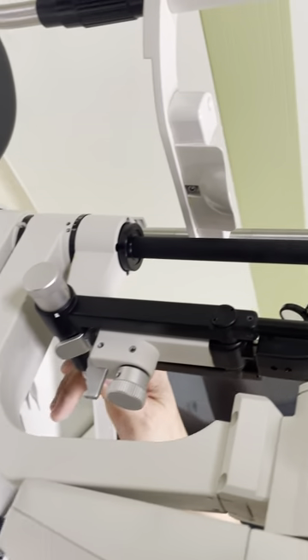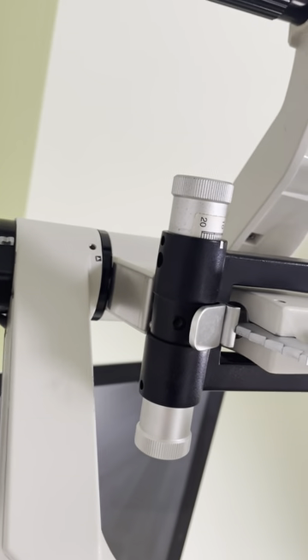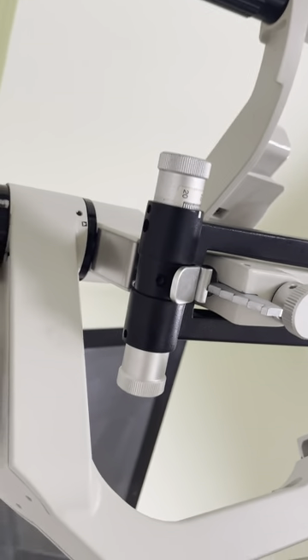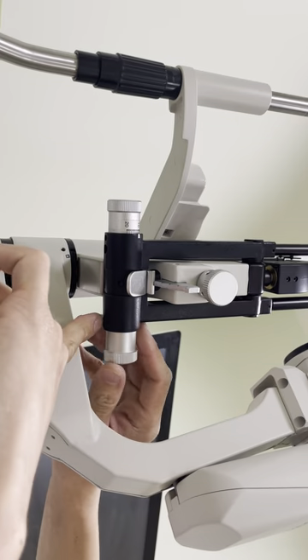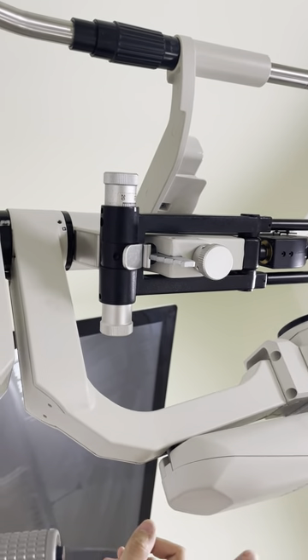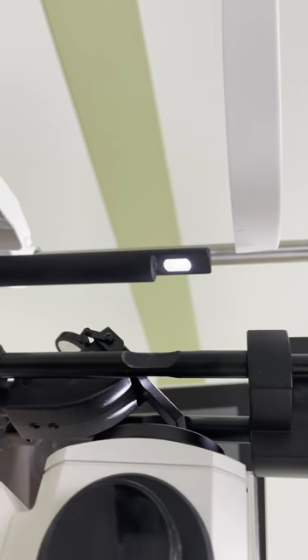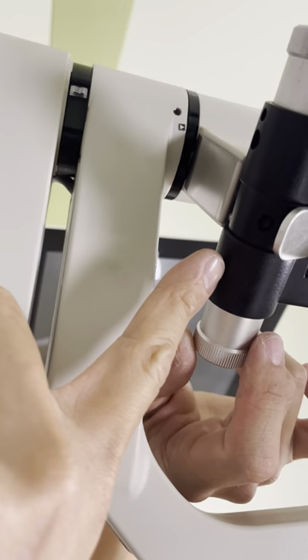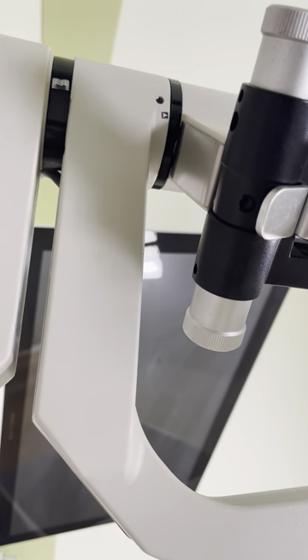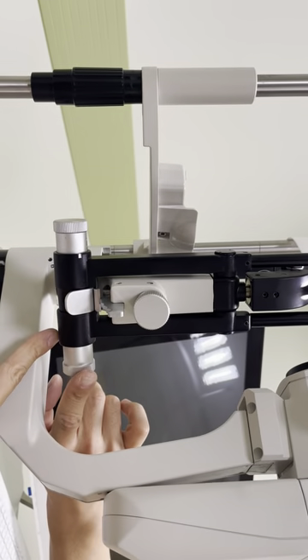One more thing — there are screws here requiring a small Allen key, 1.5 mm size, located in the down part. When you need it, you can unscrew with the Allen key and tighten this one. If the slit sometimes closes itself — for example, if you release this knob it will close itself slowly — you need to loosen this Allen screw first, then tighten this a bit, not too much, just a little. Hold this, tighten a bit, then tighten the screw back, then try again.